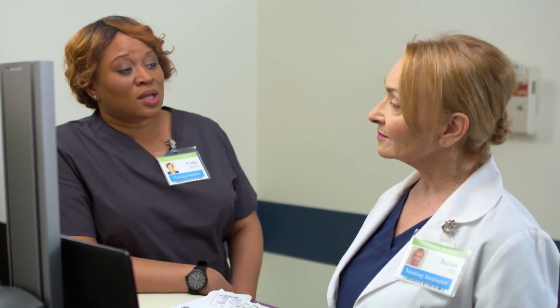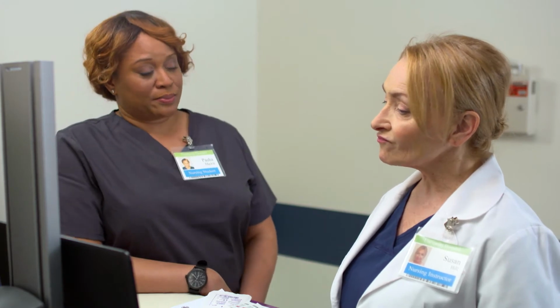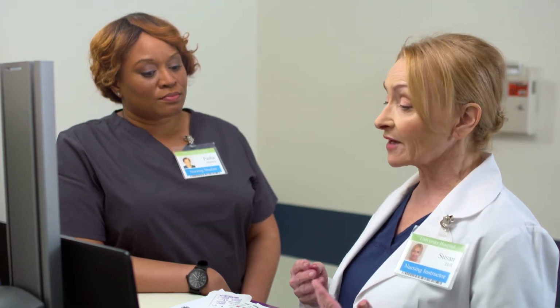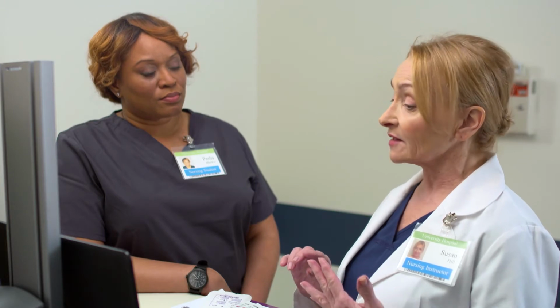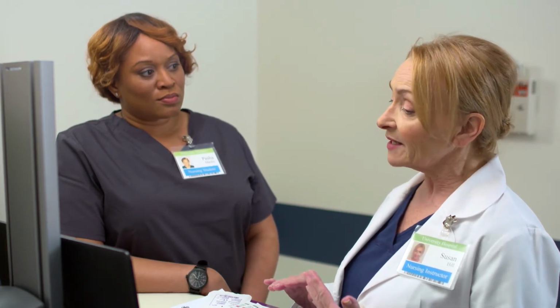As we discussed, it's to be administered via intramuscular injection at the deltoid site. Most facilities prefer the deltoid site for immunizations and the ventrogluteal site for other intramuscular injections. It's always good to verify the order and the hospital policy first. How would you respond if the patient asks you why you're giving the vaccine using the intramuscular route?